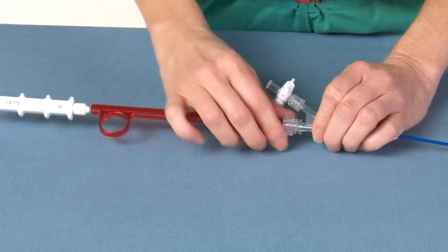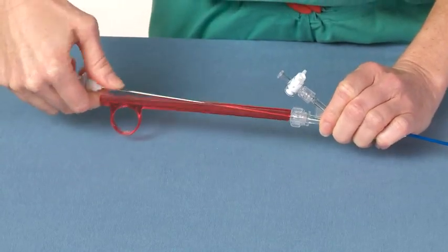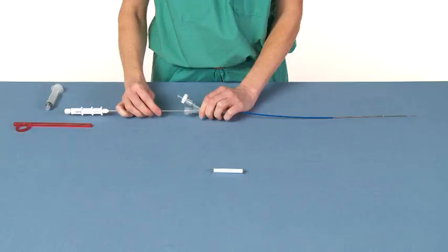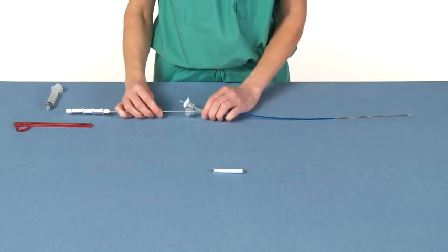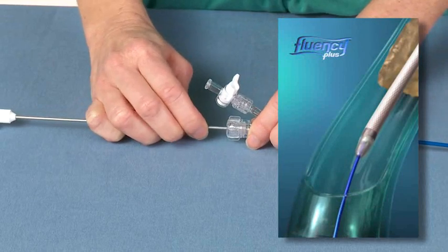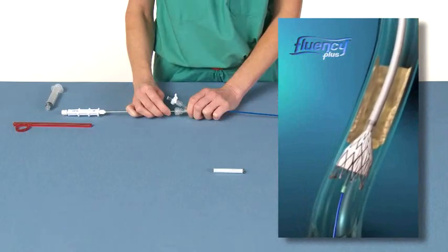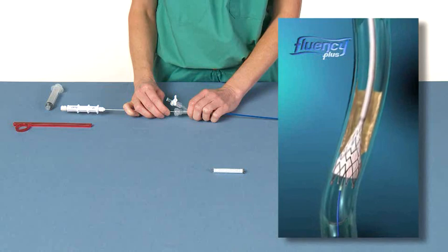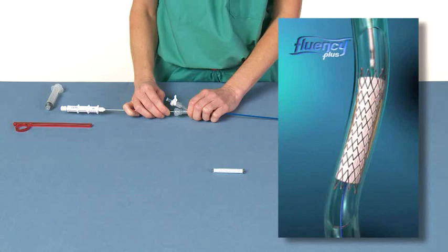Just prior to deployment, open the Tuohy-Borst valve, then remove the safety clip by pressing down on the top of the clip and pulling downward. Under fluoro, reconfirm that the stent graft position still corresponds to the lesion location. Then, slowly pull back the Y-injection adapter towards the handgrip while keeping the handgrip stationary on a fixed surface. This should be done until the Fluency Plus has expanded by approximately 15 millimeters. Then wait a few seconds to ensure secure anchoring of the distal end of the stent graft.